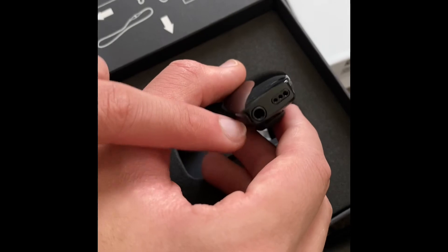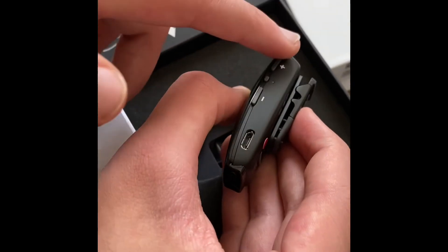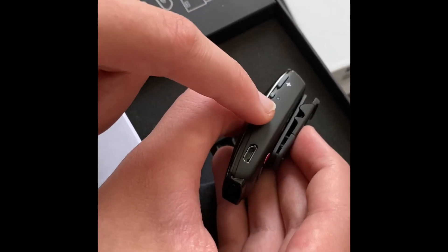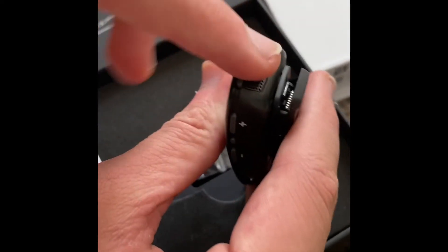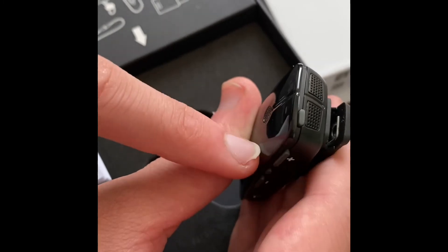Here are the volume up and down buttons. This is the mute button and this is the on/off button.